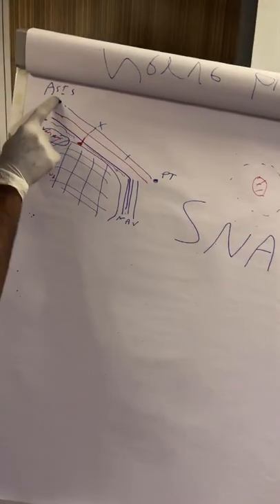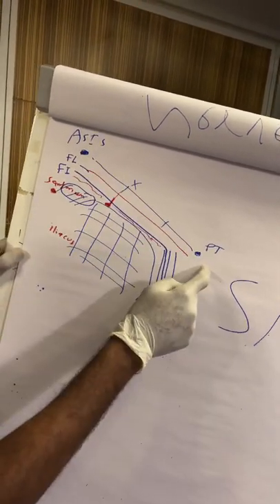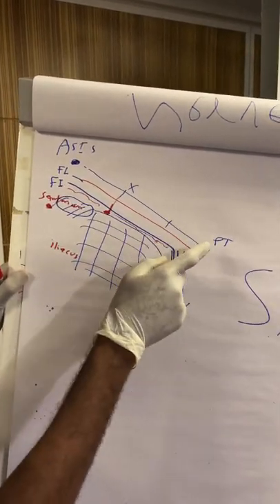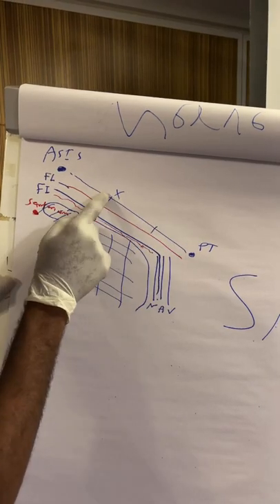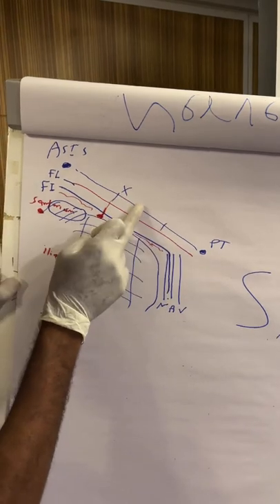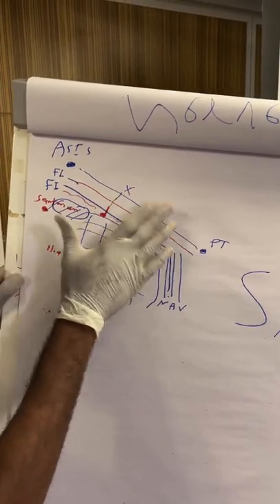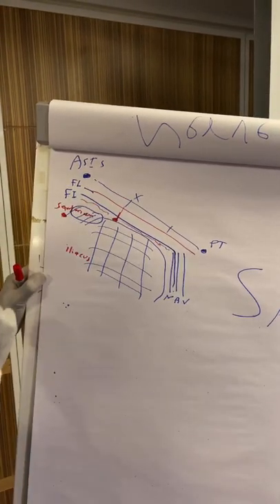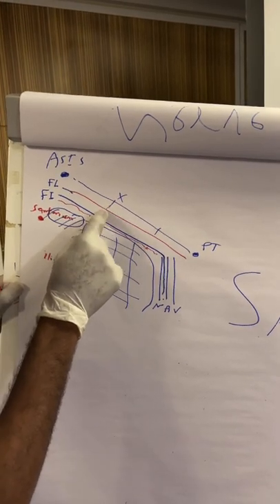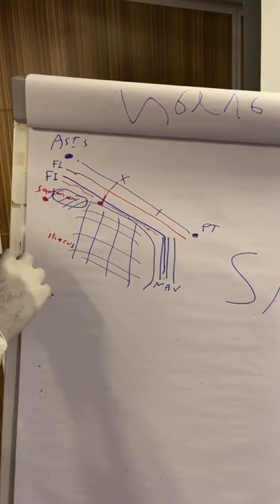So this is the anterior superior iliac spine, and this is the pubic tubercle. An imaginary line at the level of the inguinal ligament: divide that imaginary line into three parts, okay? The medial third, the middle third, and the lateral third. The landmark is at the junction of the medial two-thirds and lateral third. Okay, so at this area, you will go 1 to 2 centimeters below. And then use ultrasound, all right?